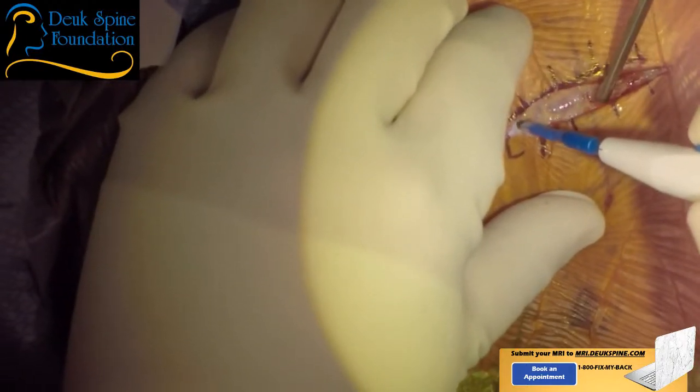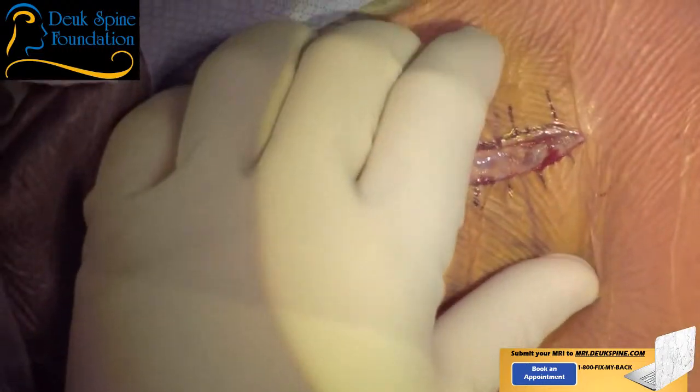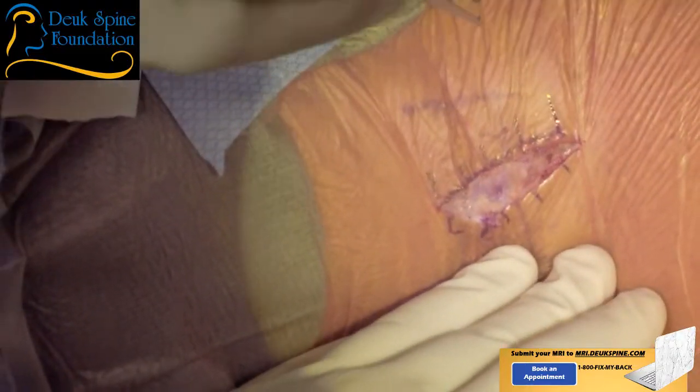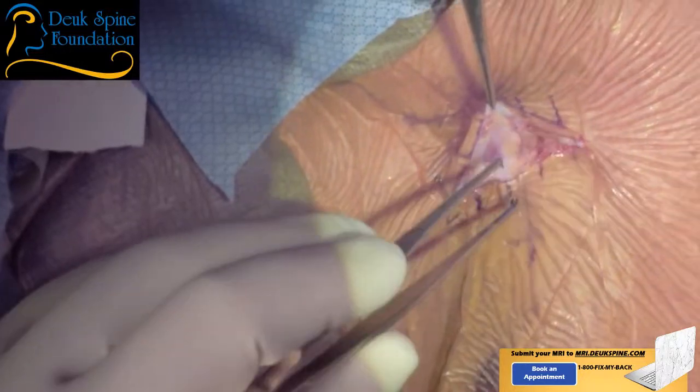There are two modes: cut and coag. You can use the cut mode on skin. You cannot use the coag mode on skin, or you'll end up burning the skin. So, pickups. Okay, very good. So let me have the Bovie.